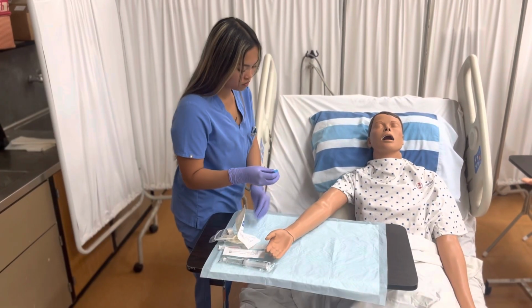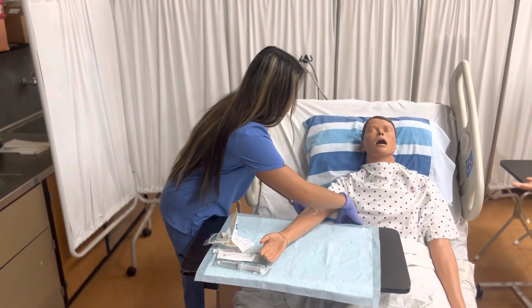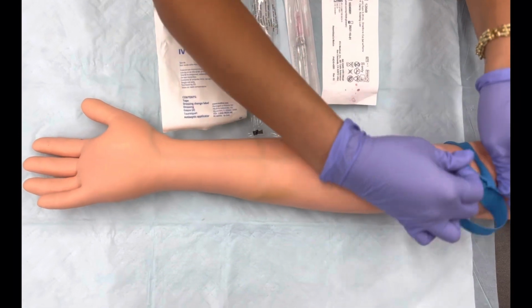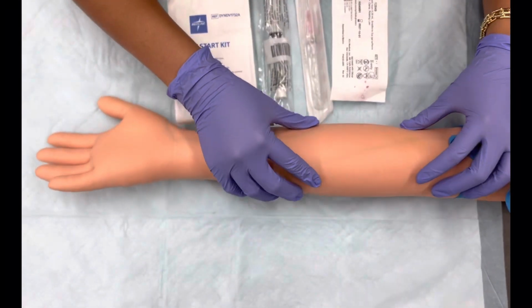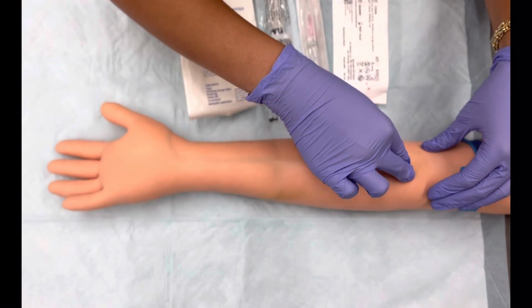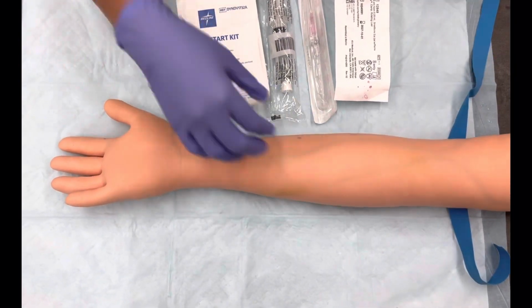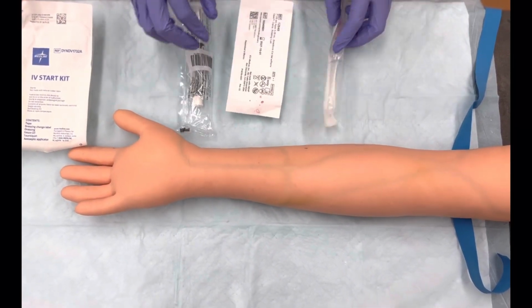After explaining the procedure to your patient, you may then apply the tourniquet above the intended IV site. After the tourniquet is tied, palpate for a suitable vein. Avoid areas with redness, tenderness, rash, pain, or infection, and any extremity affected by previous CVA, paralysis, dialysis shunt, or mastectomy. Release the tourniquet temporarily while you prepare your items for inserting the IV catheter.